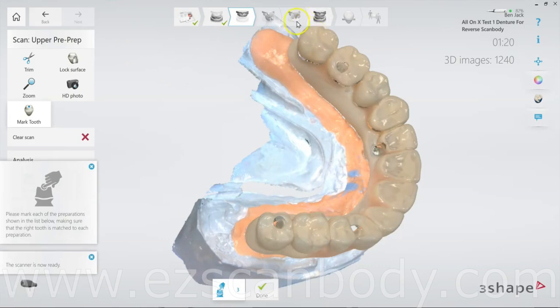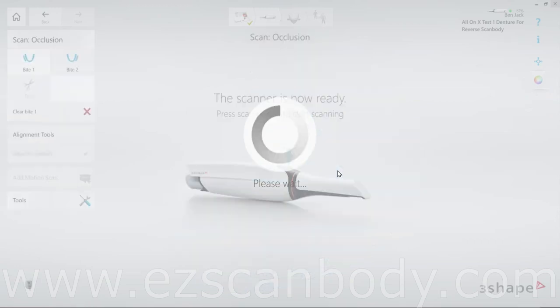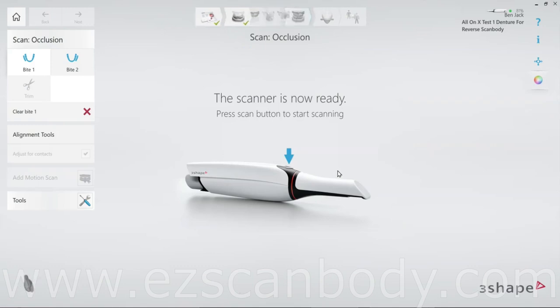Normally the next step would be scanning the jaw. However, if we remove the denture to scan the jaw now, we'll lose the bite alignment. To avoid this, we first do an occlusion scan to capture the bite. At this point, click on Occlusion in the software and proceed.